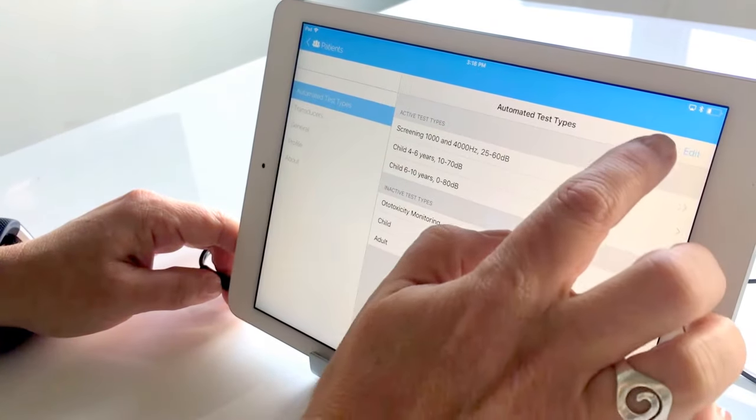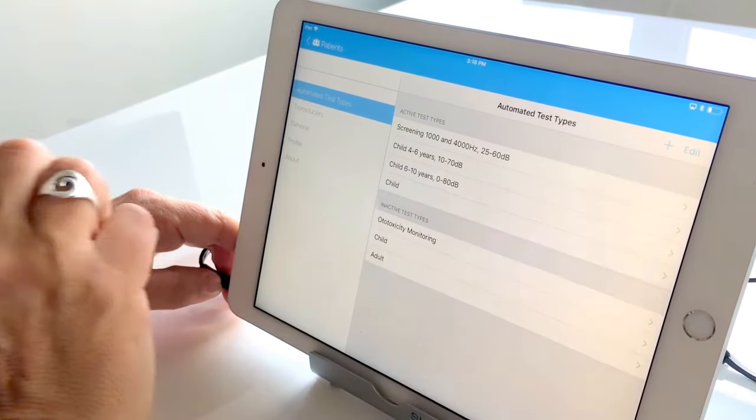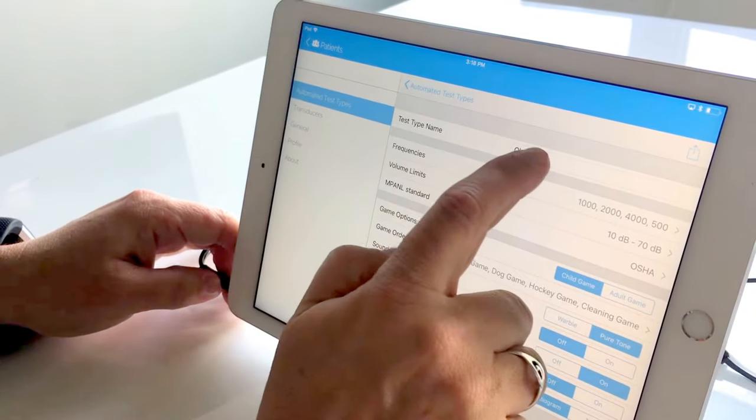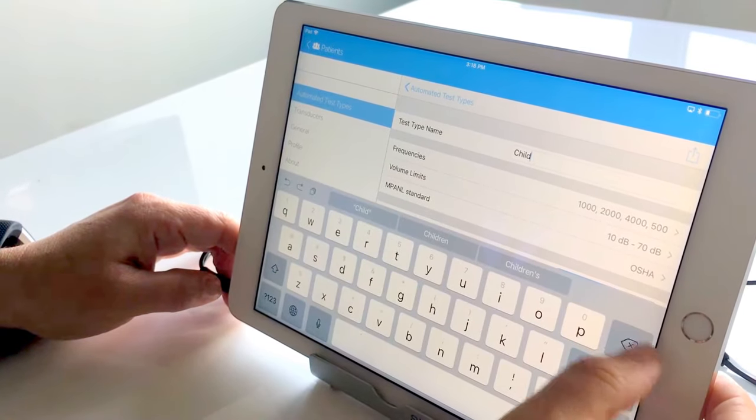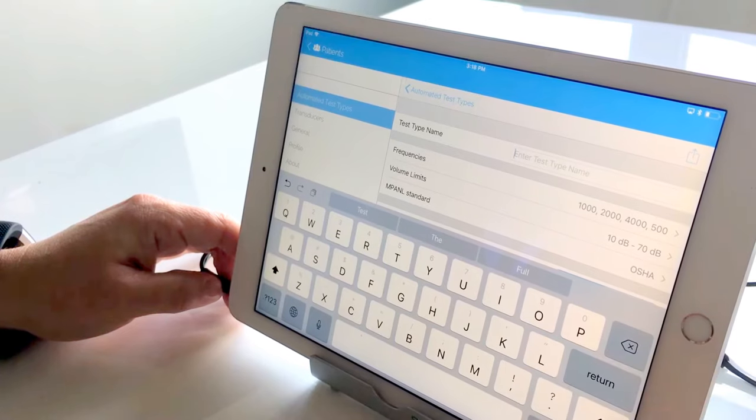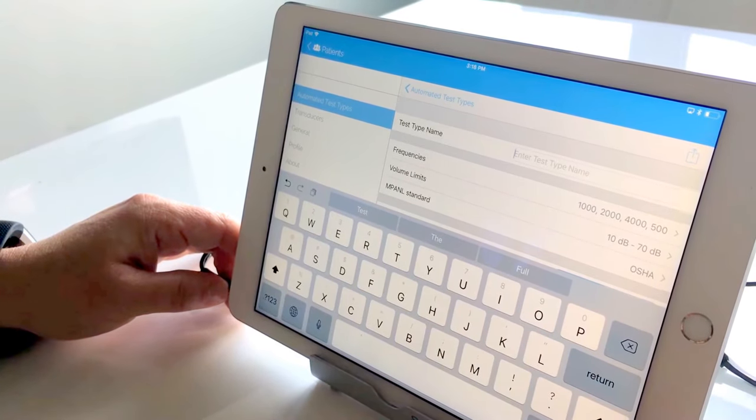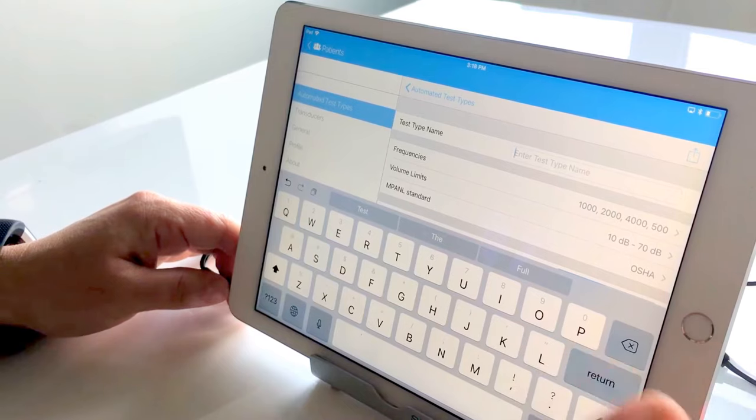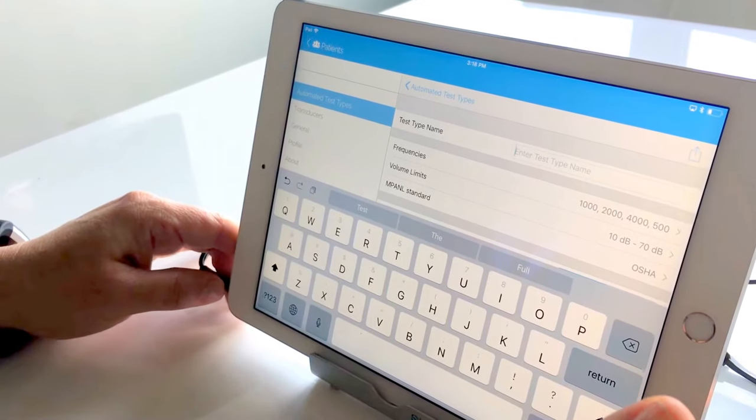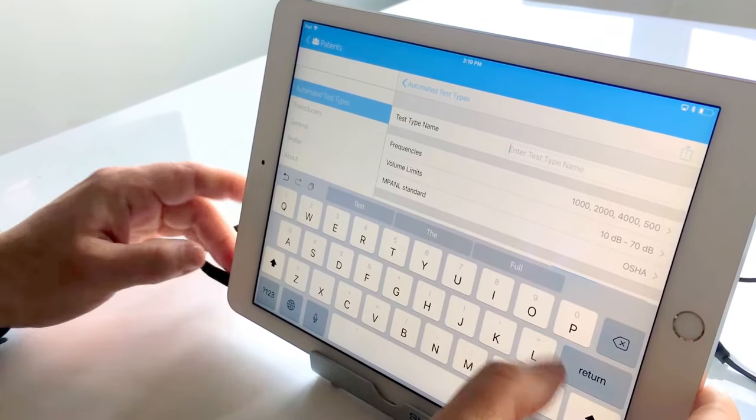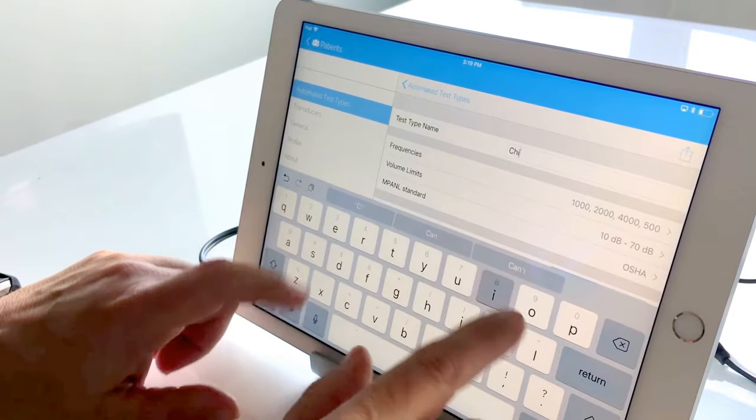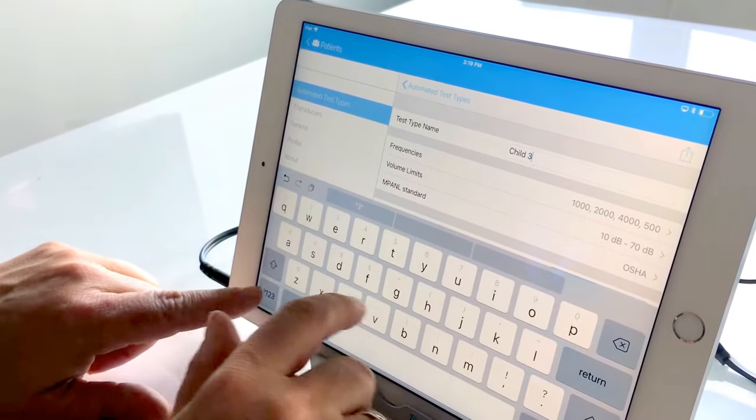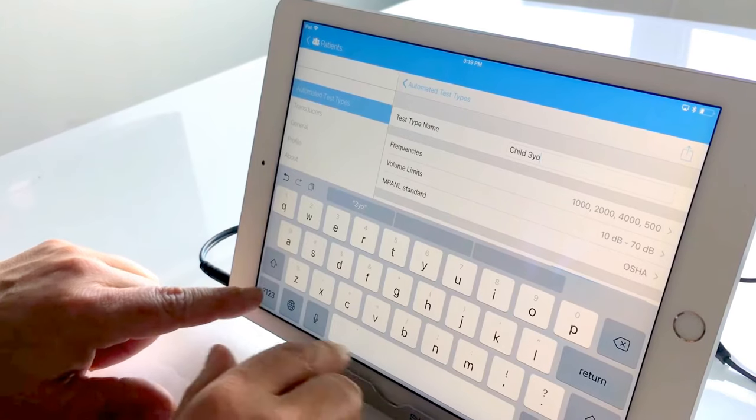So what we'll do, we'll go ahead and we'll create a new child test type. We'll open that up. I strongly recommend changing the title so that it's more specific. This is especially helpful when you have multiple people using the same system so that it's quite self-explanatory in terms of what we're looking for. So I'm going to go ahead and write child three years old plus.